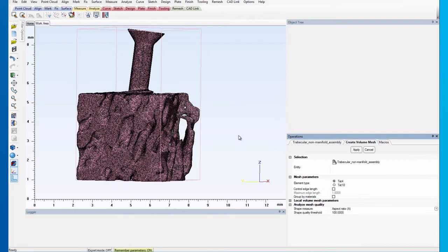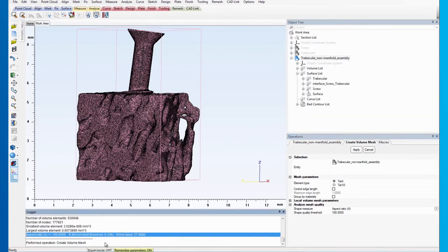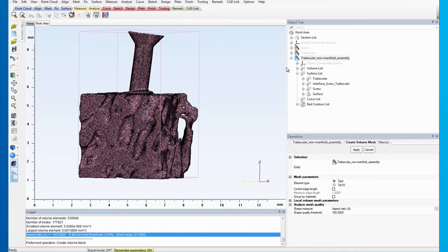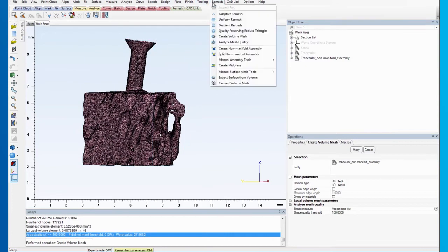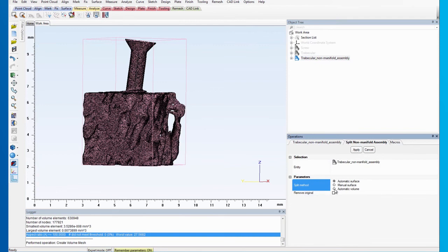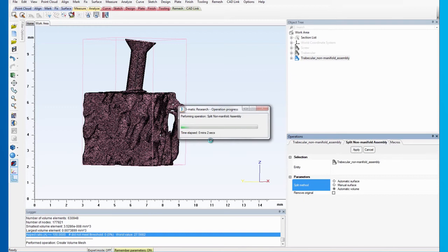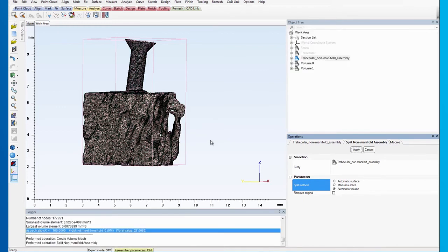Now, we can split the non-manifold assembly based on its volume mesh. Select Split non-manifold assembly from the Remesh menu and select Automatic Volume for the Split method. Now, the non-manifold assembly is split based on its volume meshes.